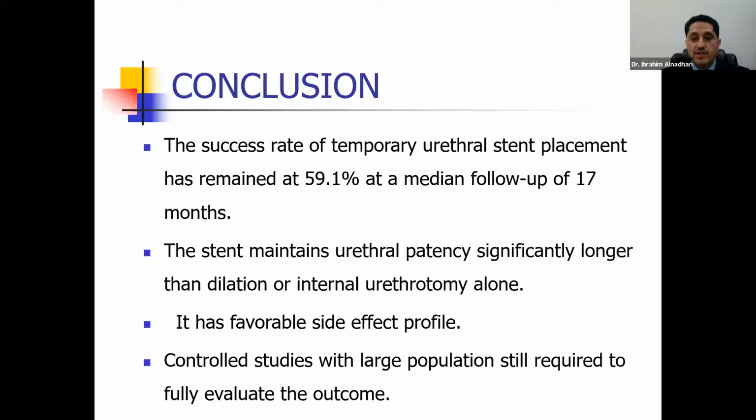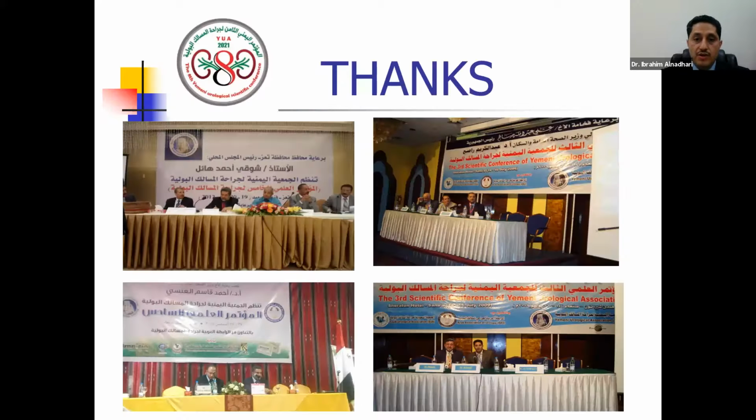Actually, the stent maintains urethral patency for a significantly longer time than dilatation or internal urethrotomy alone. It has, in general, a favorable side effect profile, and it's very important that we still need controlled studies with large populations to fully evaluate the outcome.